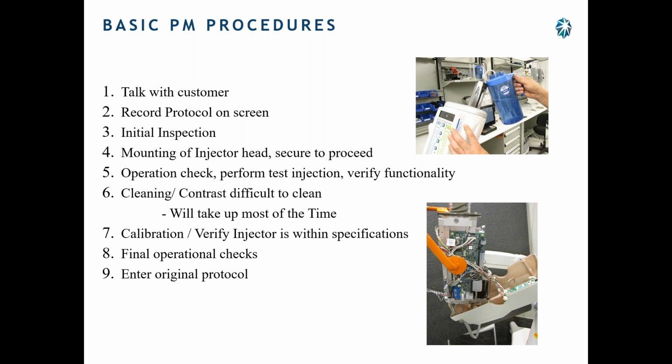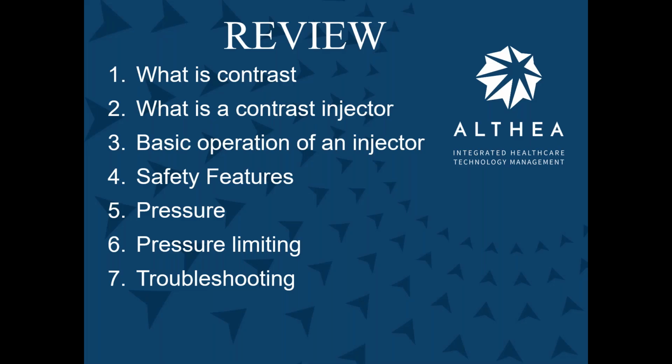They all have different specifications. If you're trained how to do it, it's not that difficult, is it? Especially on a CVI. Come on now, okay? Final operations check. Whenever you leave there, make sure it's still running the way you left it, and enter the original protocol. Don't confuse that morning tech when they come in.